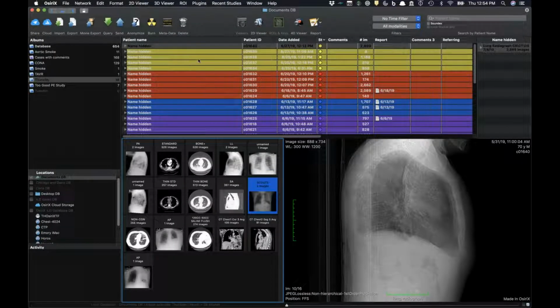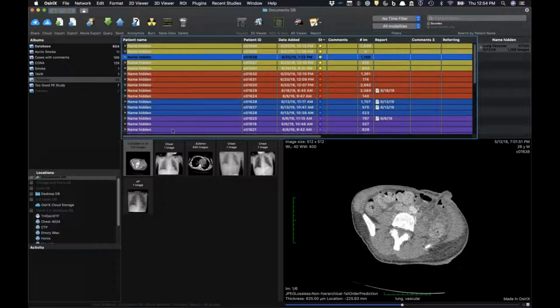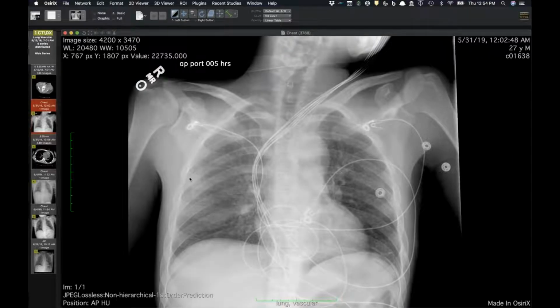So let's see. Now, this one came in last Thursday, right around the time that David did not help us set this up intentionally, but he did set it up. And this is courtesy of my colleague, Kim Kalianos, who was all over the diagnosis.